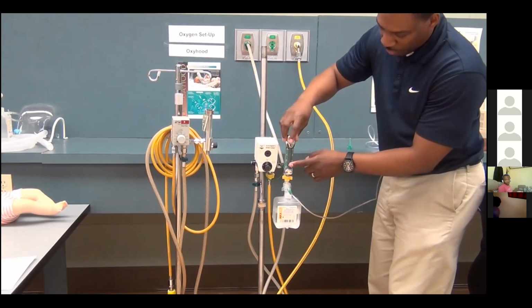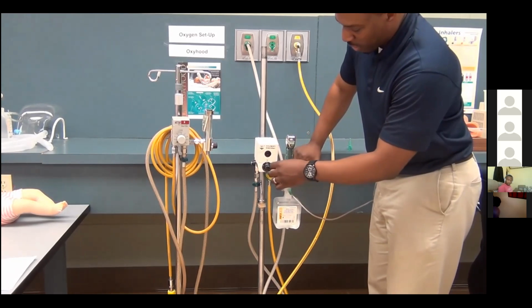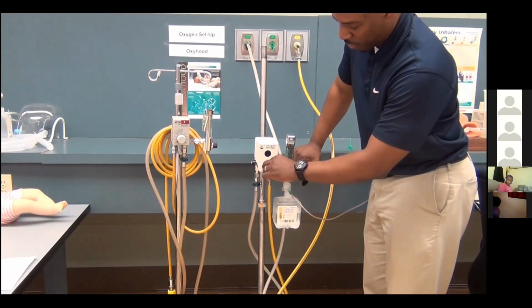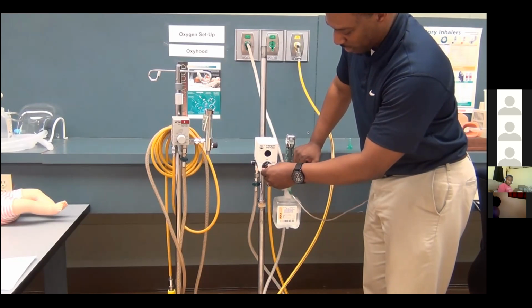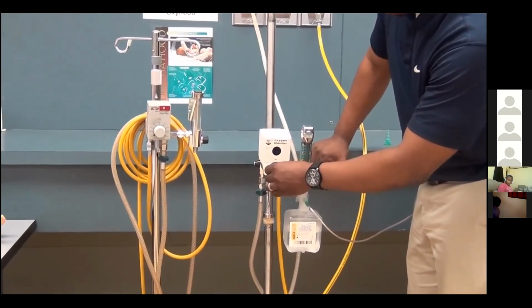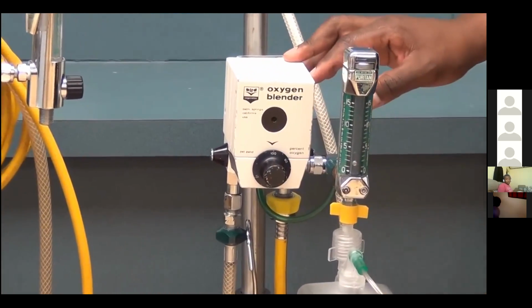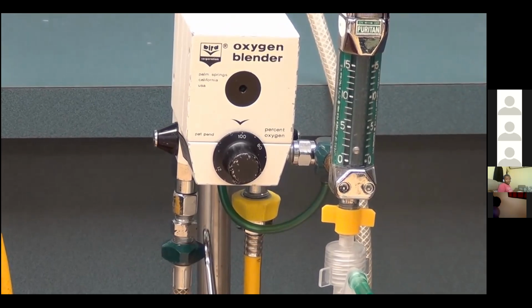So we have our 2-liter flow coming through the flow meter. Currently, our patient is receiving 40% oxygen because that is what we have our dial turned to. If we want 21%, we turn it there. Or if we want to go to 100%, then we can go there. So the blender just allows us to give an exact FiO2 to our patients. That's it.